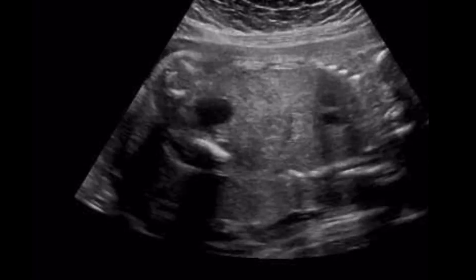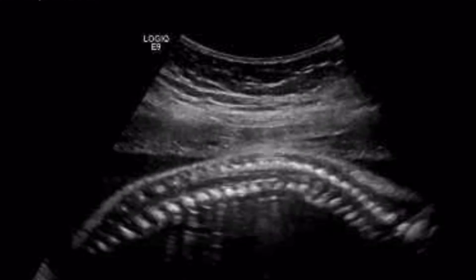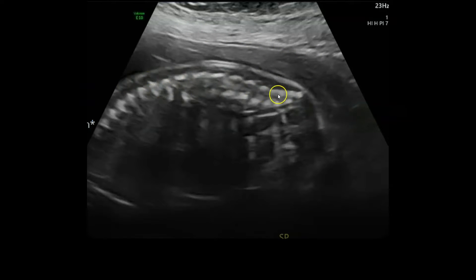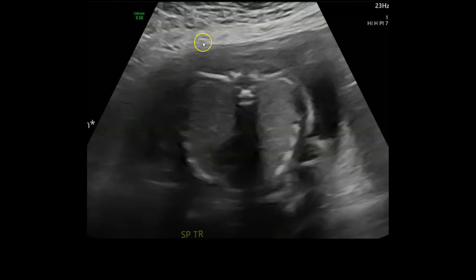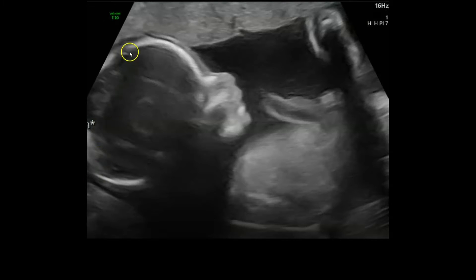Here we are in the lower uterine segment, sagittal on the maternal abdomen. We have the spine and the sacrum, so we know this baby is breech — spine facing the mother's anterior. Mom's spine would be back here, baby's spine is here, mom's head would be over here, and baby's head is also here. Now if you go transverse on the abdomen, you're also going to get a transverse fetal chest — and remember, spine facing mother anterior. Also keep in mind, fetuses move, so it may be breech with the spine facing the mother's anterior, and a few moments later it'll be breech with the spine facing the mother's posterior.